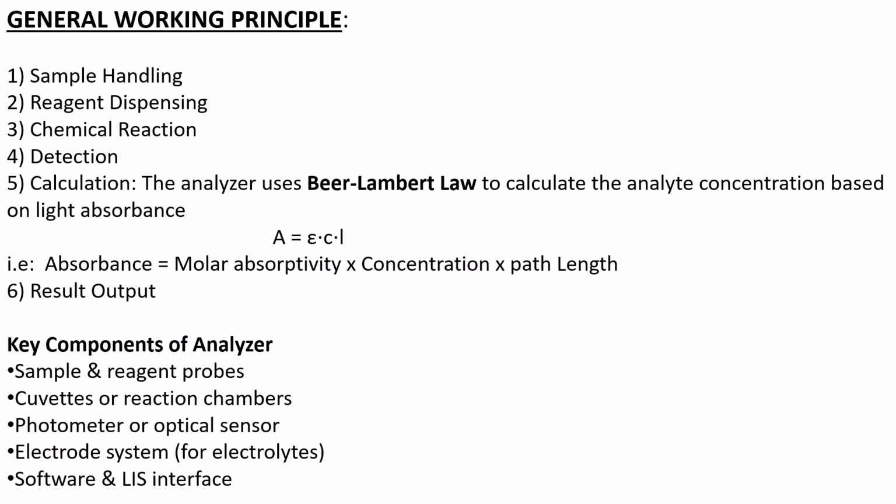The key components of the analyzer are the sample and the reagent probes, the sample storage section and the reagent chambers, the cuvettes, then the photometer or optical sensors, the electrode system for ISEs, and the software and LIS interface.